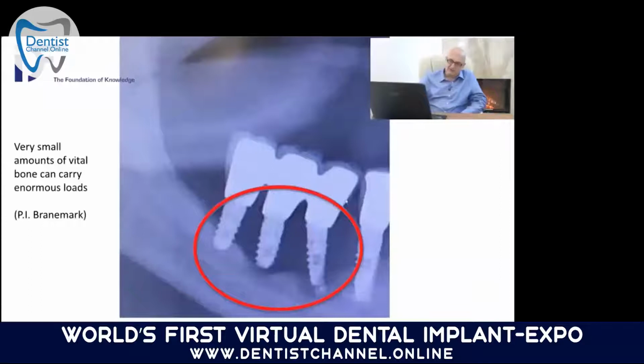Now, this picture is also interesting for the dentists listening here, or implantologists, because we are being told by the university or by the textbooks that the surface of an implant should be made as large as possible. And in order to get the surface of a solid body large, they can sandblast it, they can acid etch it, and so on. This acid digs deep into the surface of the implant and etches it out. Then, of course, we get these undercuts, and the surface is larger than before.